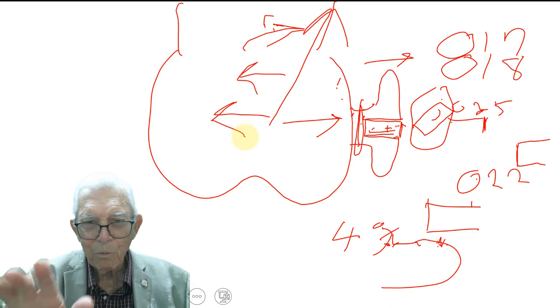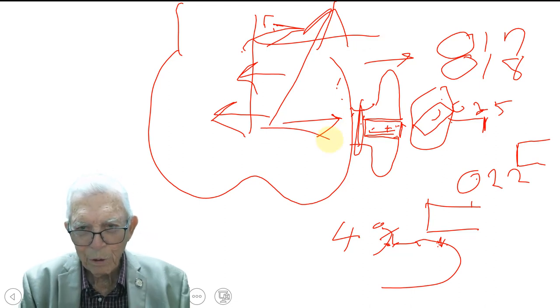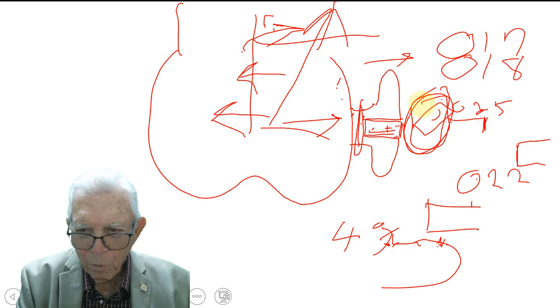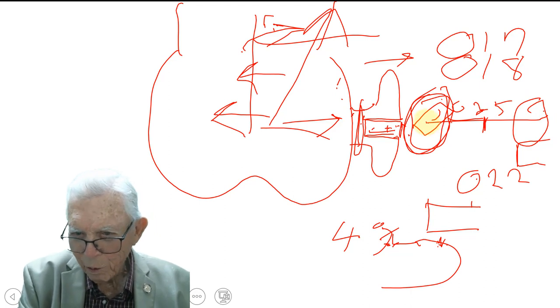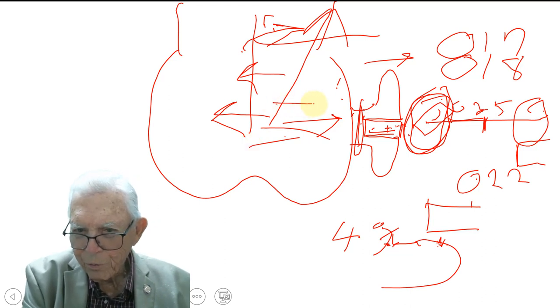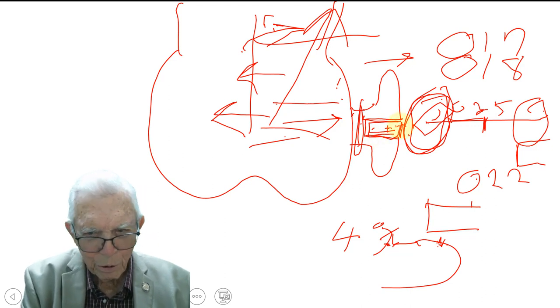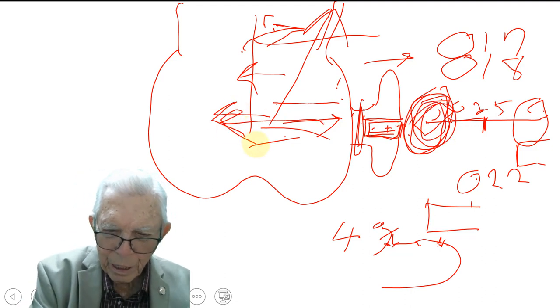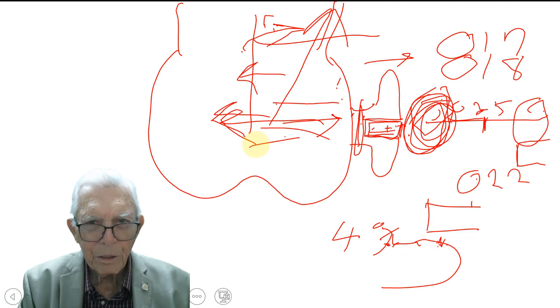We do not want that — we want this tooth brought out bodily. When we expand it, we want the tooth to move out. So we put this large arch wire over here, overlay it over the bracket wire, and it will not let the crown go in lingually, so this carries the tooth out and carries the roots out with it. Your arch wire carries the roots out. If you didn't have this big wire in here, the crown would move in a lingual direction. So don't try to torque with a large round wire — that's not what it's meant for.